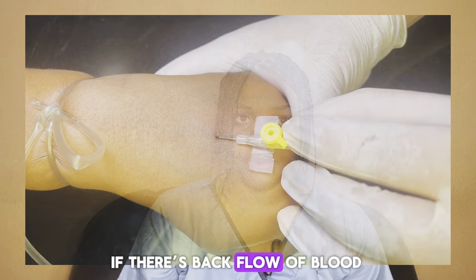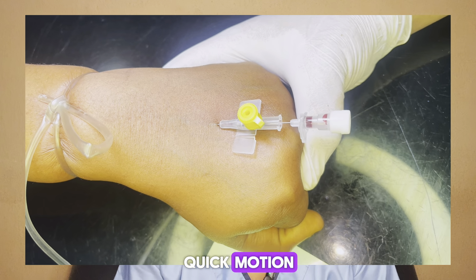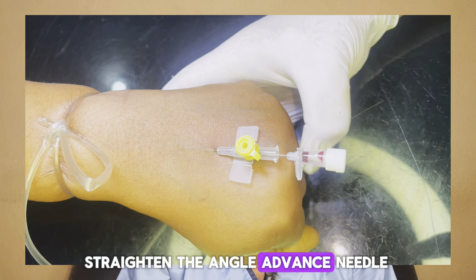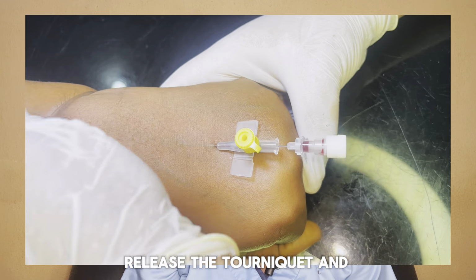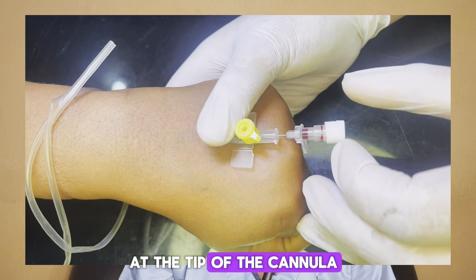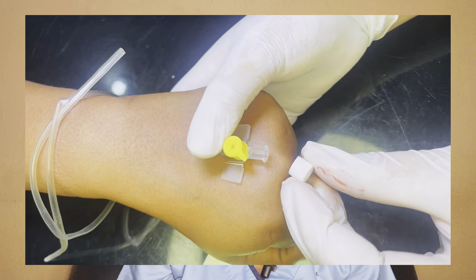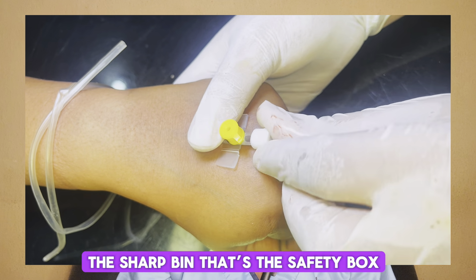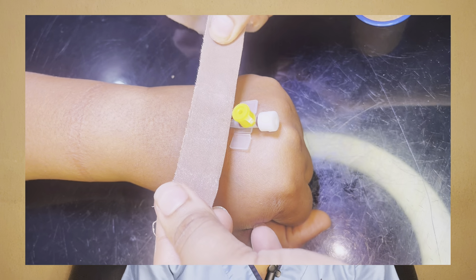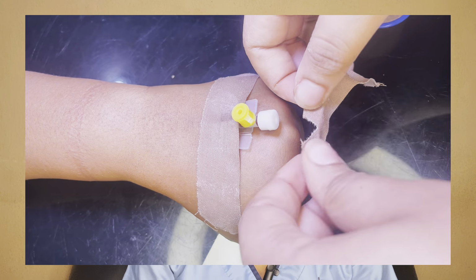If there is backflow of blood, slide the cannula into the vein in one quick motion. If backflow of blood is invisible, straighten the angle, advance the needle. Release the tourniquet and apply gentle pressure at the tip of the cannula. Remove the needle fully. Remove the cap of the needle and put it at the end of the cannula. Put the needle in the sharps bin, that's the safety box. Then secure the cannula with tape. A padded splint, which I told you about, can be put especially in children or infants.